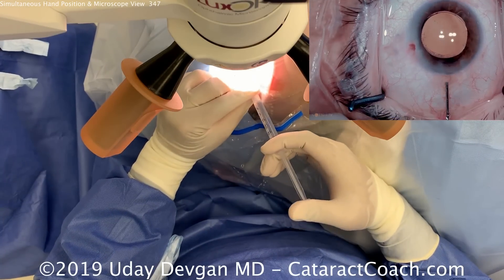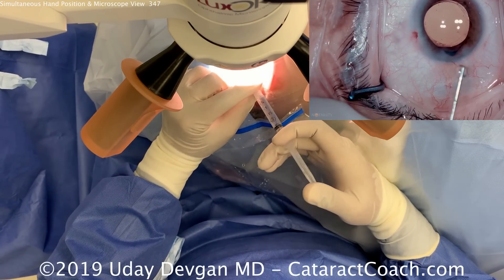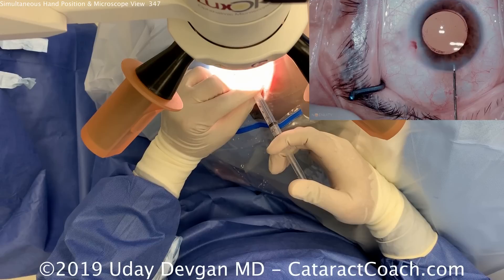Now it's time to seal up the incisions. Holding the tip of the cannula with the left hand, right hand on the plunger — nice, good control. A little iris prolapse; we'll push that back in the eye. And a little more hydration of the incision.